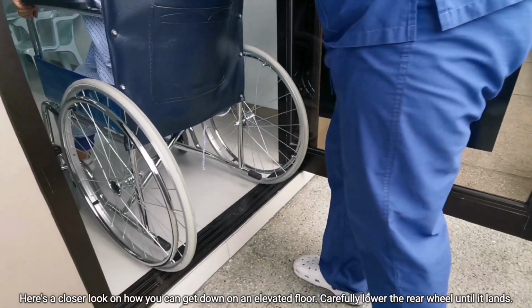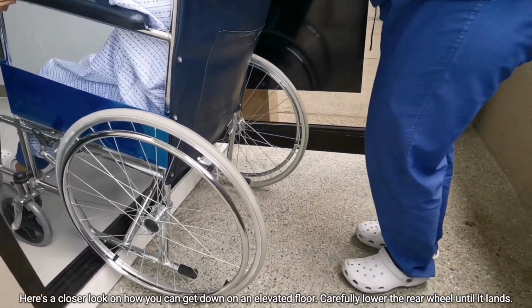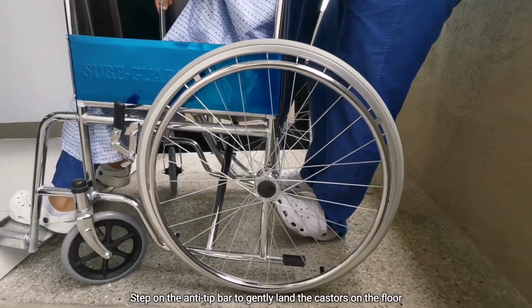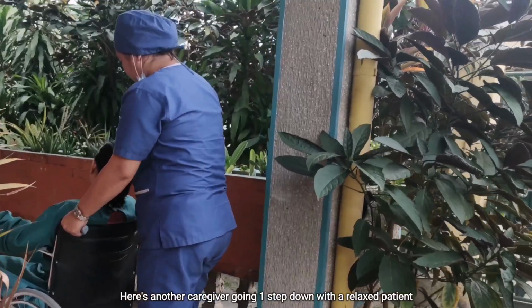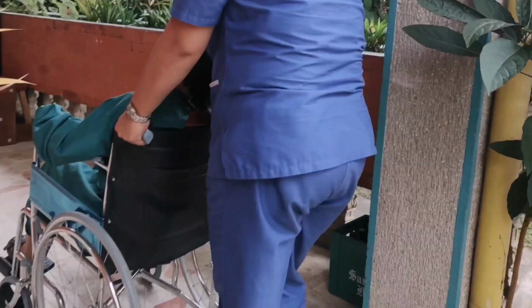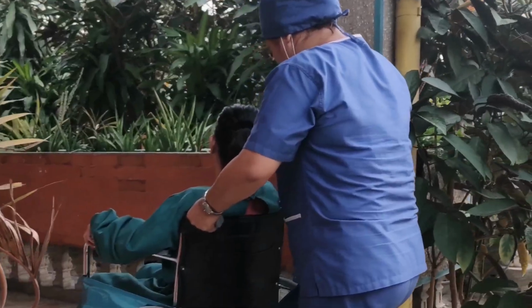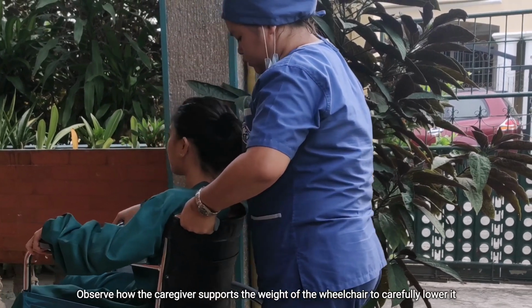Here's a closer look on how you can get down on an elevated floor. Carefully lower the rear wheels until it lands. Step on the anti-tip bar to gently land the castors on the floor. Here's another caregiver going one step down with a relaxed patient. Observe how the caregiver supports the weight of the wheelchair to carefully lower it.